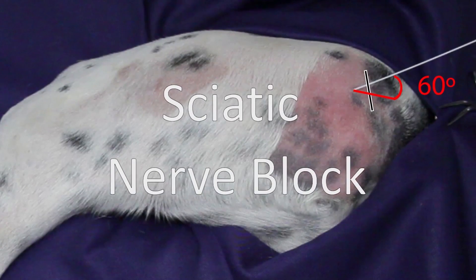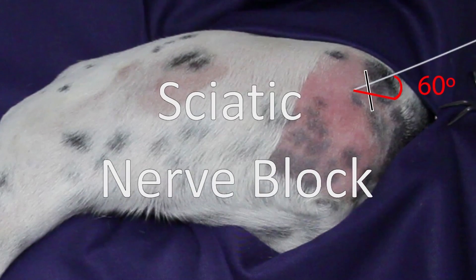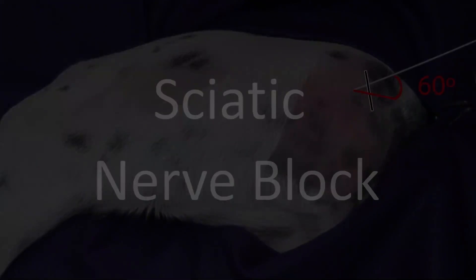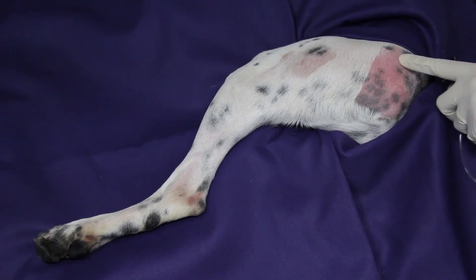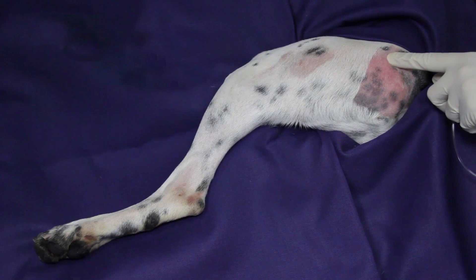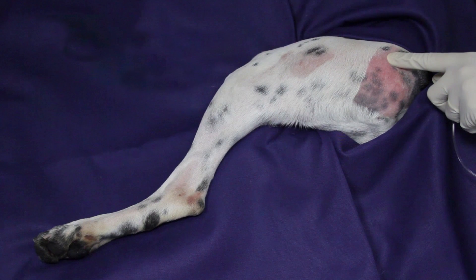The sciatic nerve block. Using the lateral approach for the sciatic nerve block, the dog is positioned in lateral recumbency.